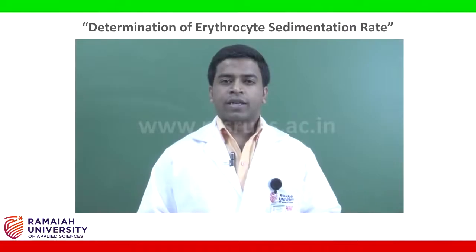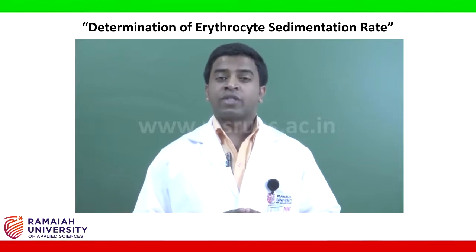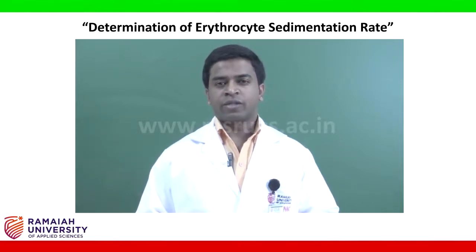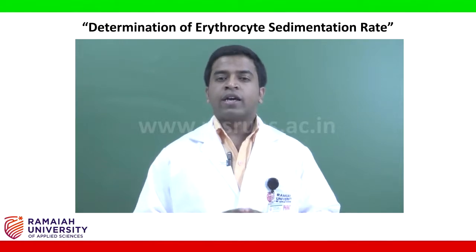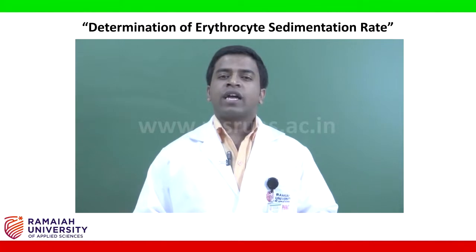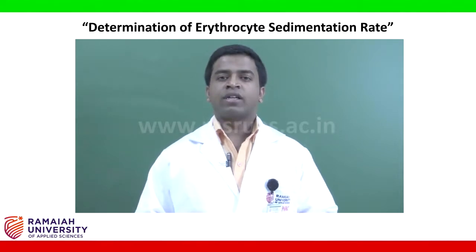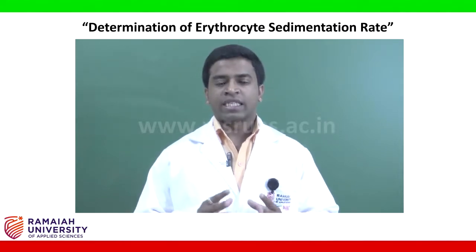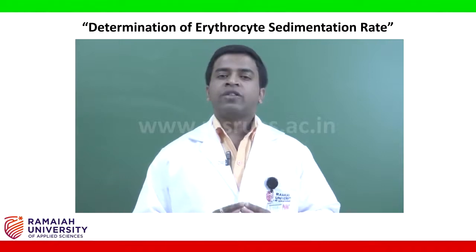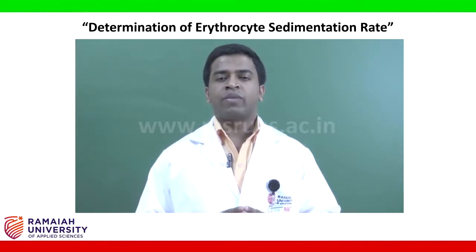Hi students, today we are going to study erythrocyte sedimentation rate. The aim of this experiment is to study the significance of erythrocyte sedimentation rate in ruling out the presence of organic diseases. Erythrocyte sedimentation rate reflects the tendency of settling of RBCs, that is red blood cells, in the presence of diseased conditions. Erythrocyte sedimentation rate is usually done as a part of complete blood analysis.